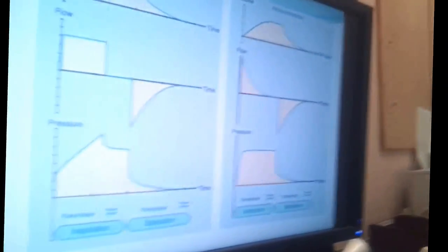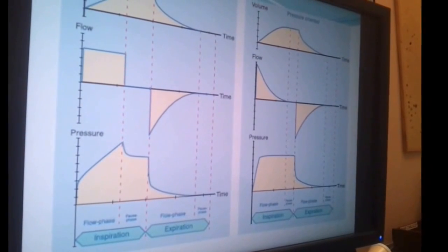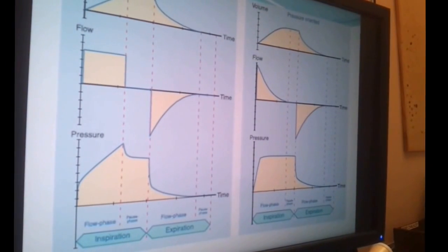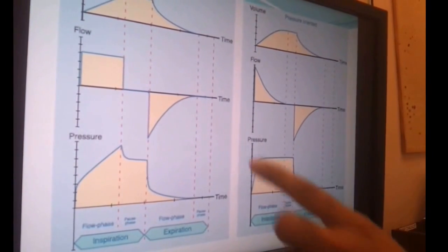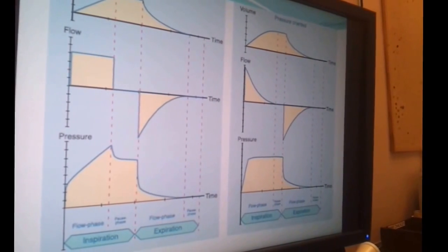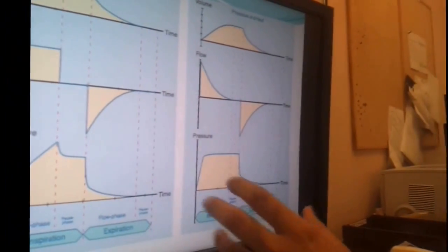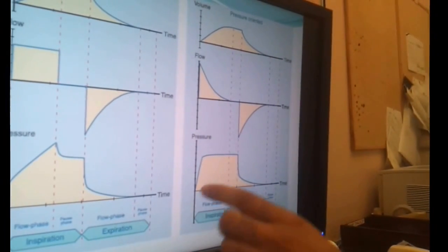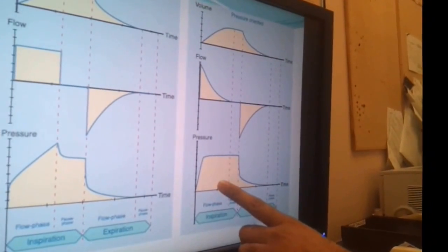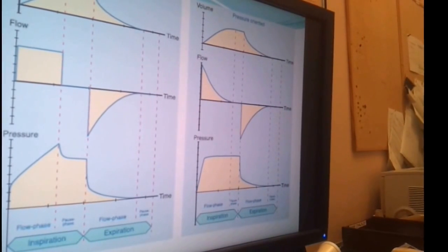Now I'm talking about the usual people, like commonalities. Okay, you could be able to tell this patient has got asthma or has got ARDS. So he's got a compliance problem or a resistance problem. Okay. The problem is that you lose this sort of technical information or academic information, one could say, which may not impact any outcomes when you put autoflow on. That's one downside of autoflow, but it's got huge benefits.